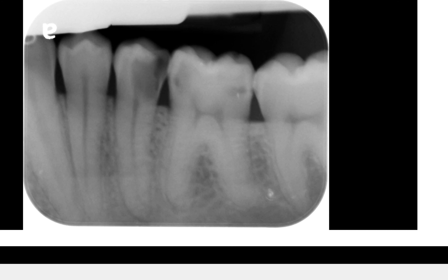Hello everyone, this is Sung Kim. In this video, we're going to look at how graft material appears in CBCT scan after extraction and potential anatomic considerations that you should pay close attention to, especially if you're doing an implant treatment plan in the premolar region.